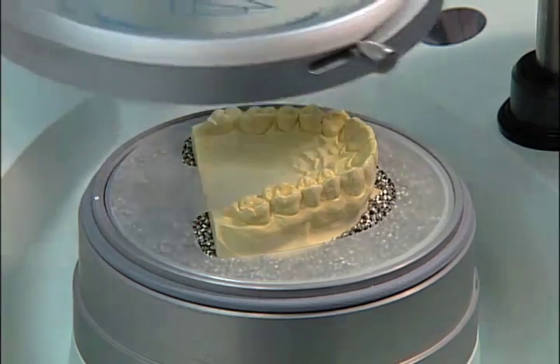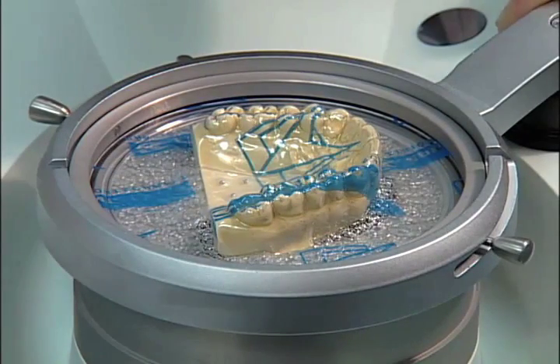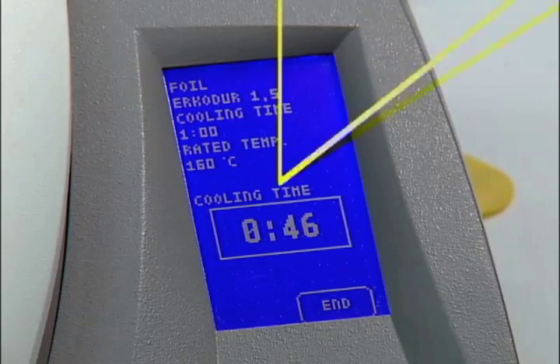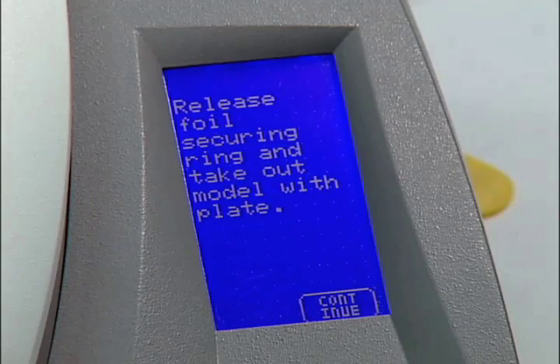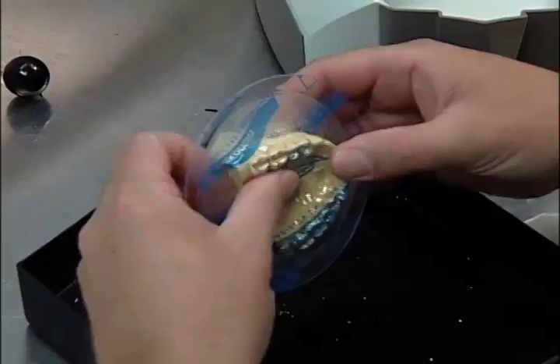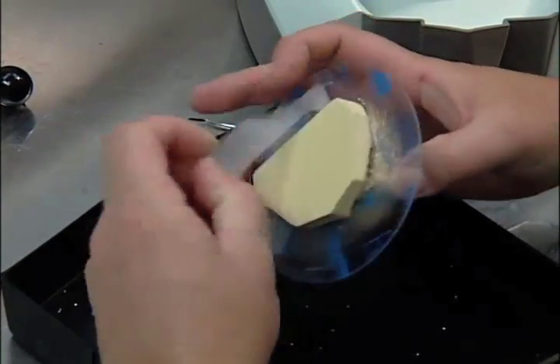Turn the foil ring over the model and down. Press slightly to thermoform. The cool down timer will begin automatically. After the cool down cycle is complete, remove the foil lock ring and remove the foil disc. Brush off any loose granules and remove the granulate template cover.